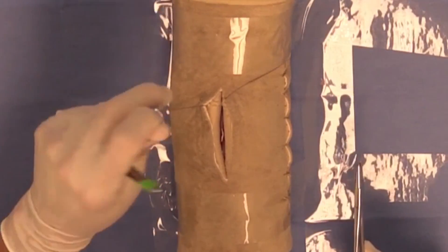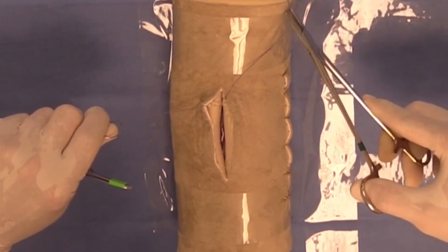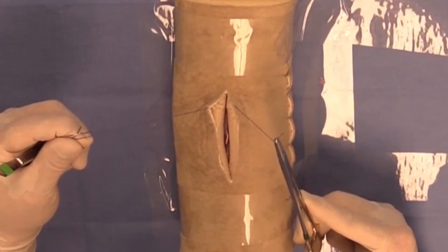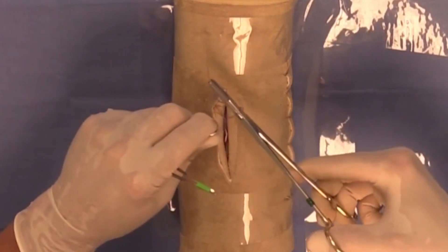Both arms of the suture, both limbs of the suture are in subcutaneous tissues. Now some surgeons would elect to bury the knot to begin this suture pattern. I'm not burying the knot so you'll see that the knot now is exposed.